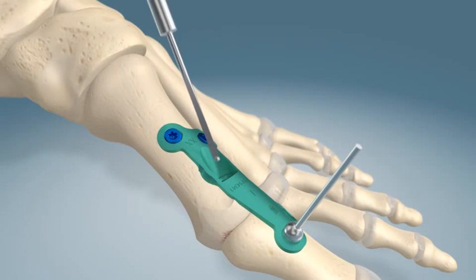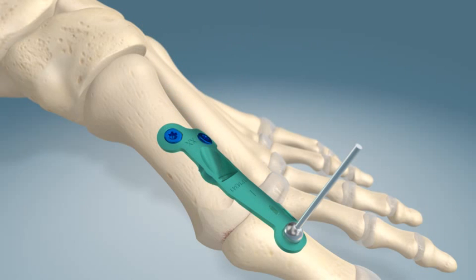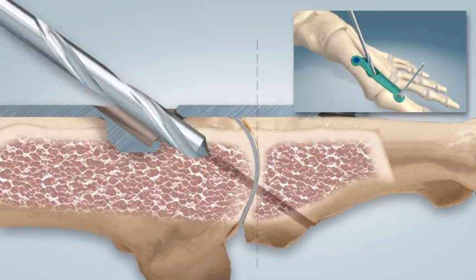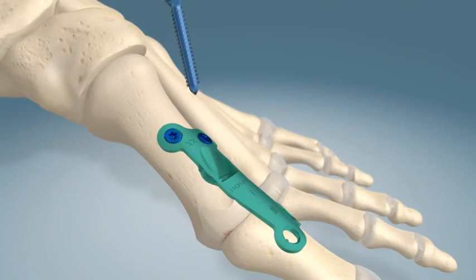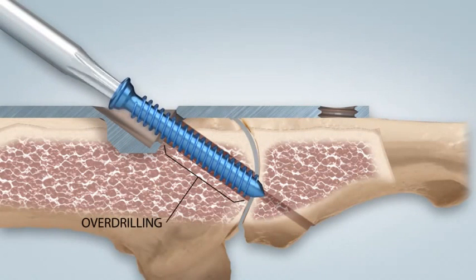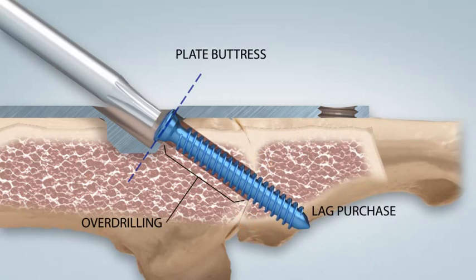Once reamed, the drill guide is removed and the corresponding hole is measured using the provided depth gauge. The recommended over-drilling technique is achieved by advancing a 3.0 millimeter drill bit through the cross joint hole to the joint line. After screw length is verified, a non-locking 3.0 screw is placed in the hole and advanced across the joint and tightened against the plate. This buttressed lag effect compresses the joint as the screw is tightened.